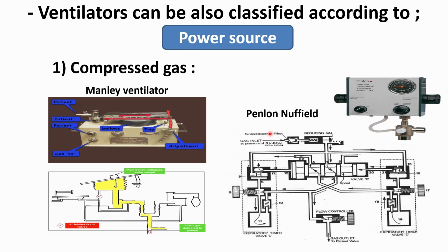bag-in-bottle is a very common device. You only adjust inspiratory and expiratory time and the flow. When you switch it from off to on, it doesn't need any electricity. It will start pushing the fresh gas flow without the need of any electricity. This device is not safe and you cannot use it in major or critically ill patients. You have no alarm.